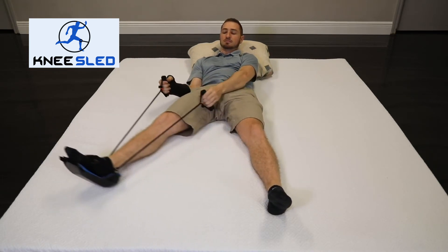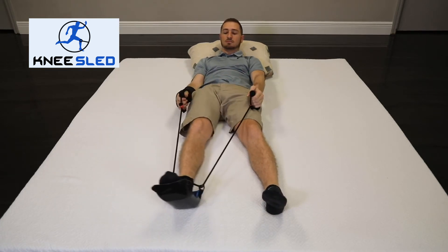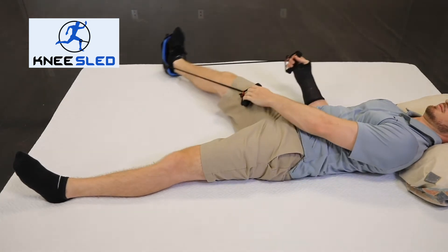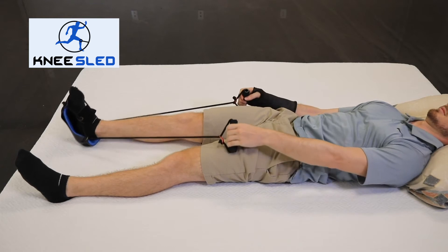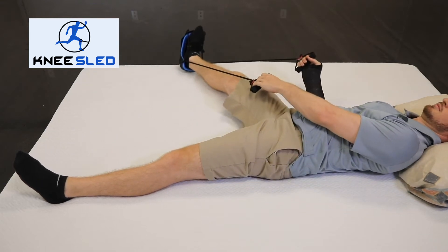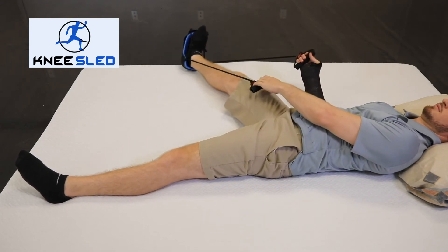Pull on the rope to assist you in this motion. Continue to slide your leg out to the side until it becomes a little uncomfortable, as you will feel some pressure inside your hip. At that point, slide your leg back to the starting position, keeping your heel on the bed, and then repeat as ordered by your doctor or physical therapist.